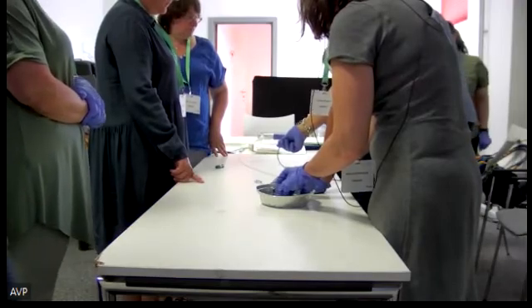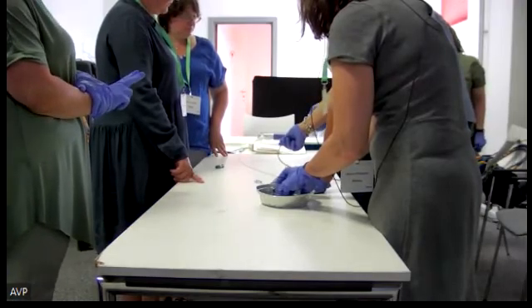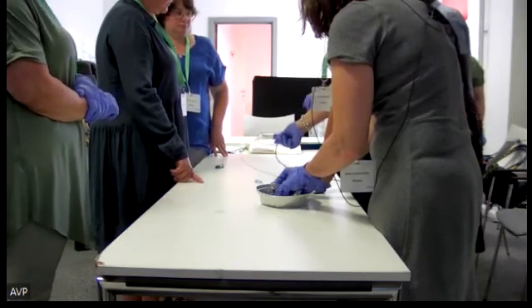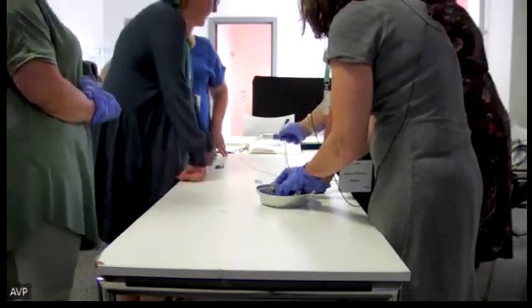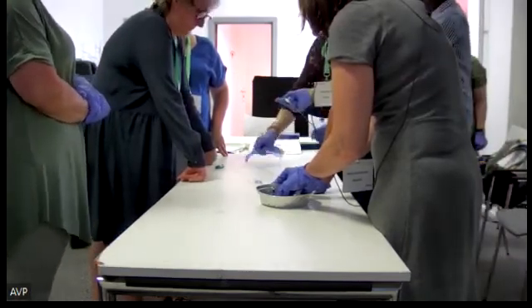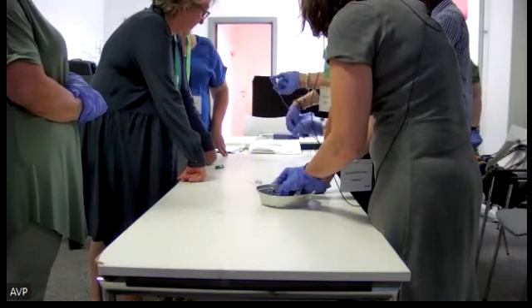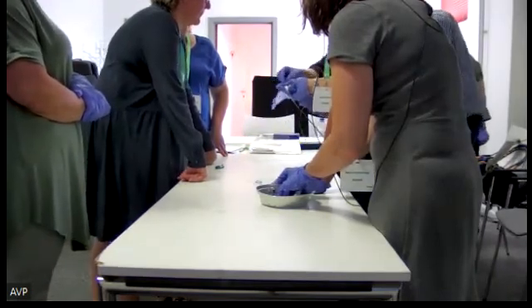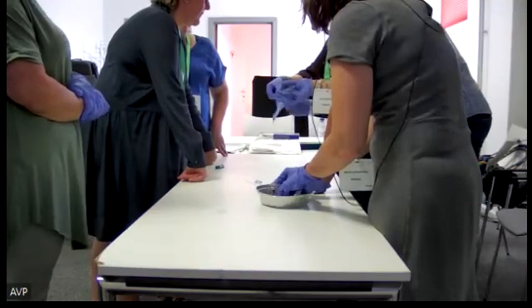Only two, or three? Yes. It's 0.035. If you use the 8.5 cystotome, you can push two 0.025 guide wires.